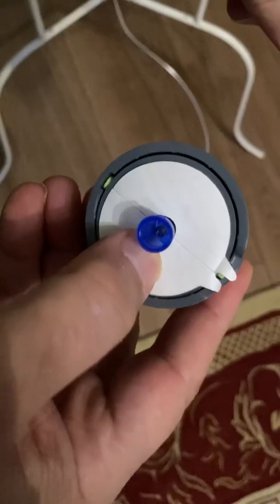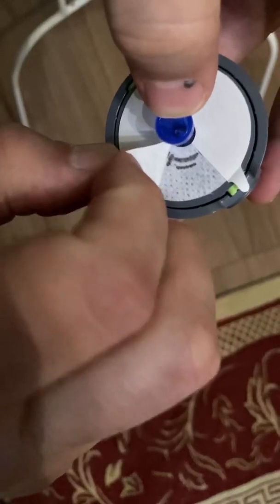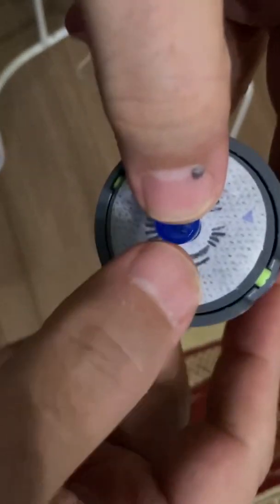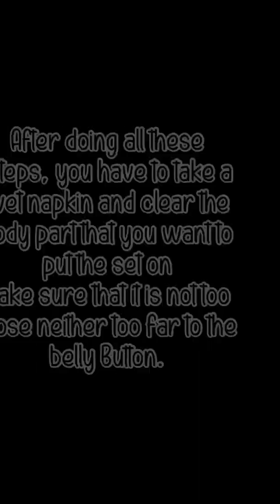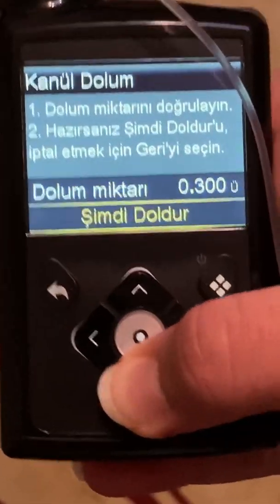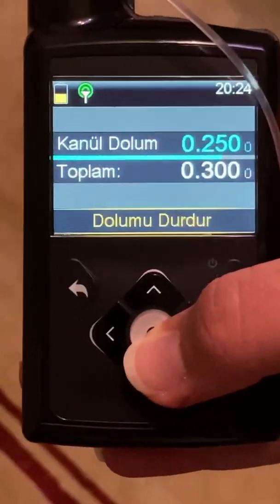Now you have to see the drops again. Do the in-and-out move and try to remove the white parts. Then press the middle button to open the pump and complete these steps.